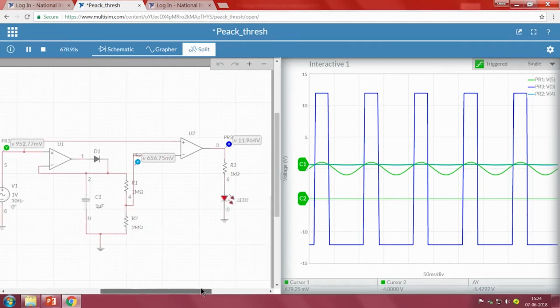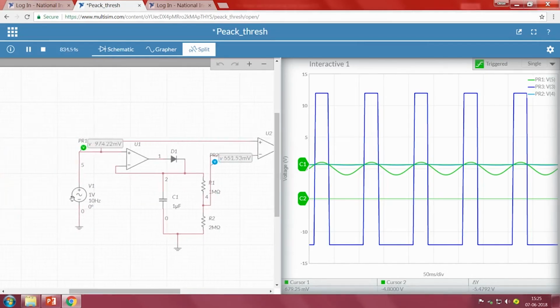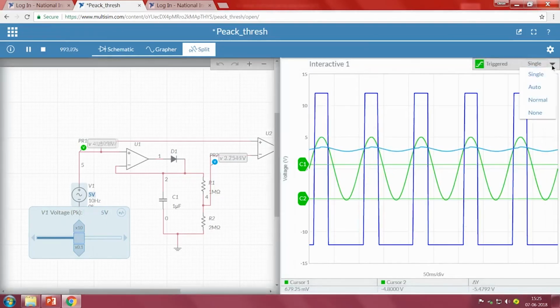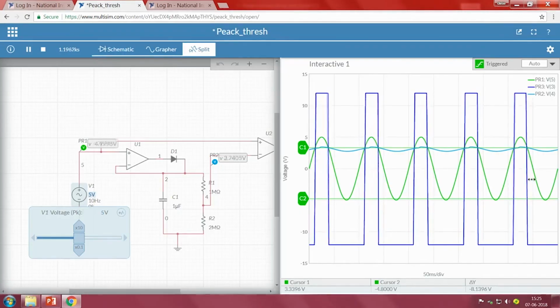Now whenever the input is greater than the value, we can also see the LEDs keep on blinking, right. If I change the input voltage, even thresholds, everything will change. So let me make it as 5 and change this to auto, right. We can see the threshold is also changed, and this is the input and this is the threshold and this is the output that we are getting. So that means the thresholding part, everything is working fine for our application.